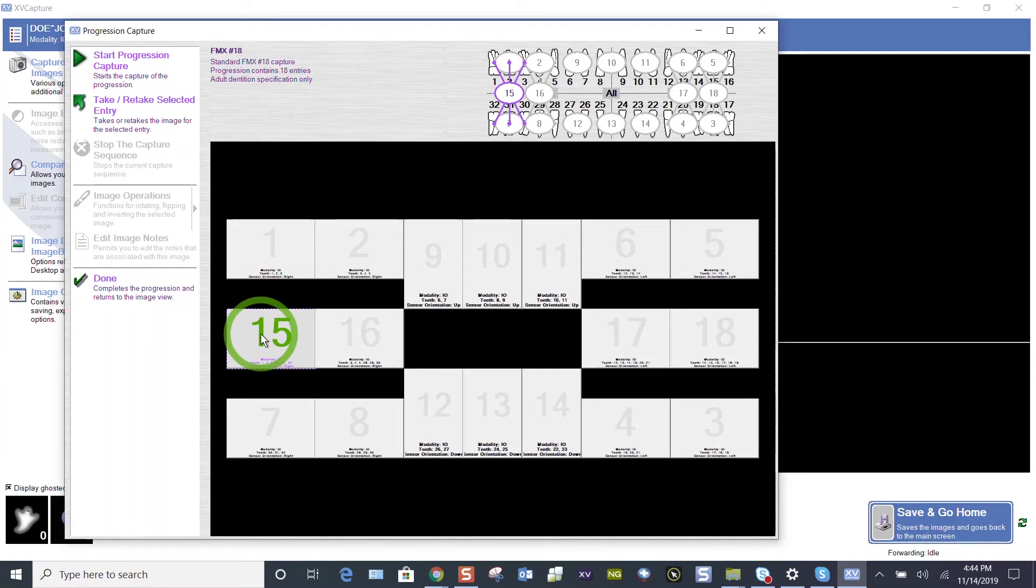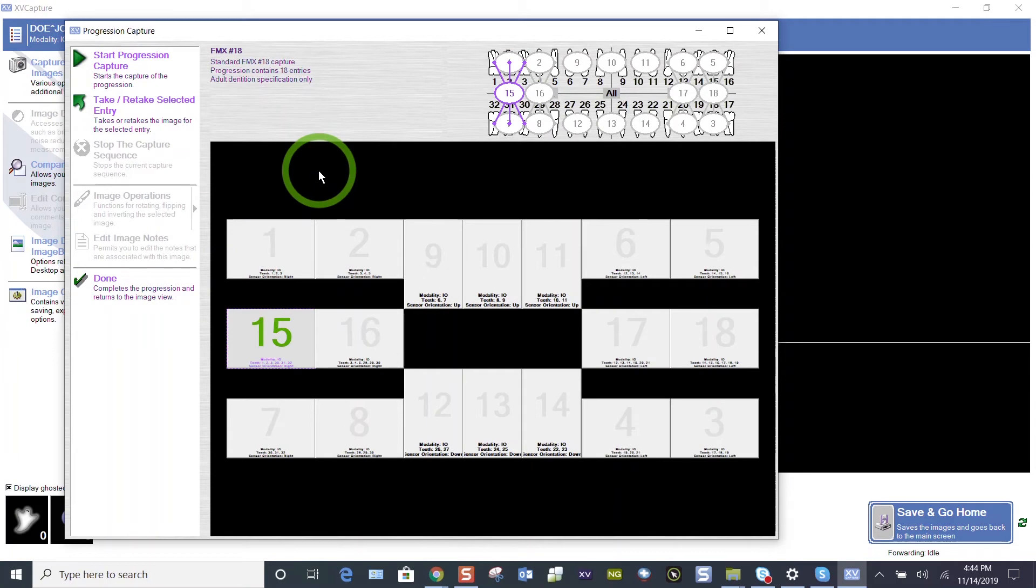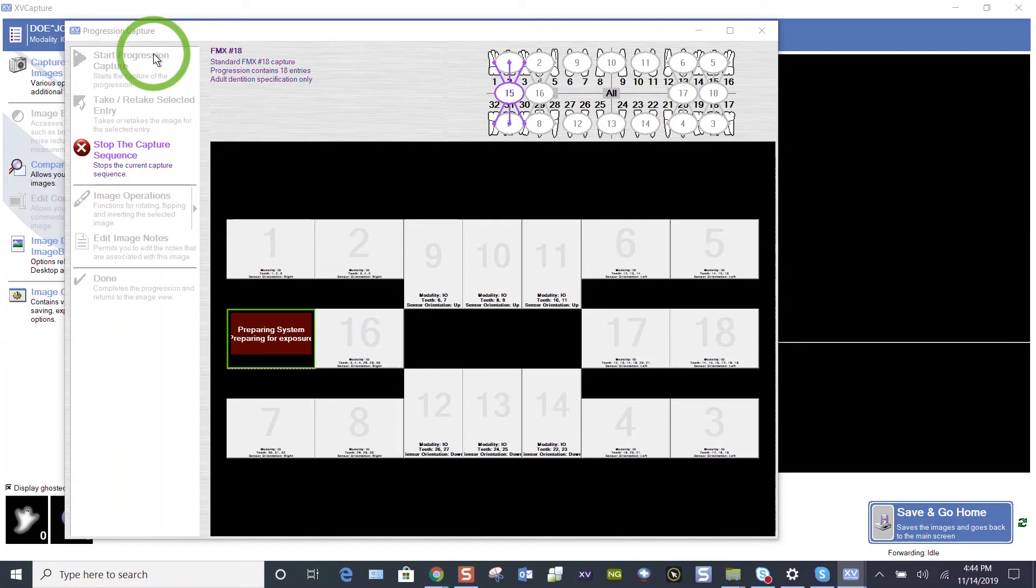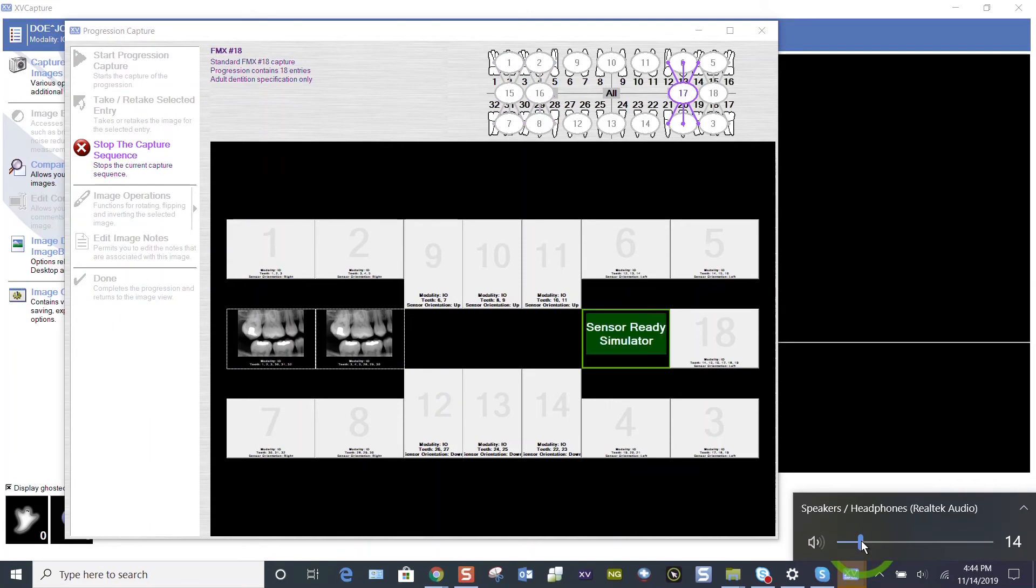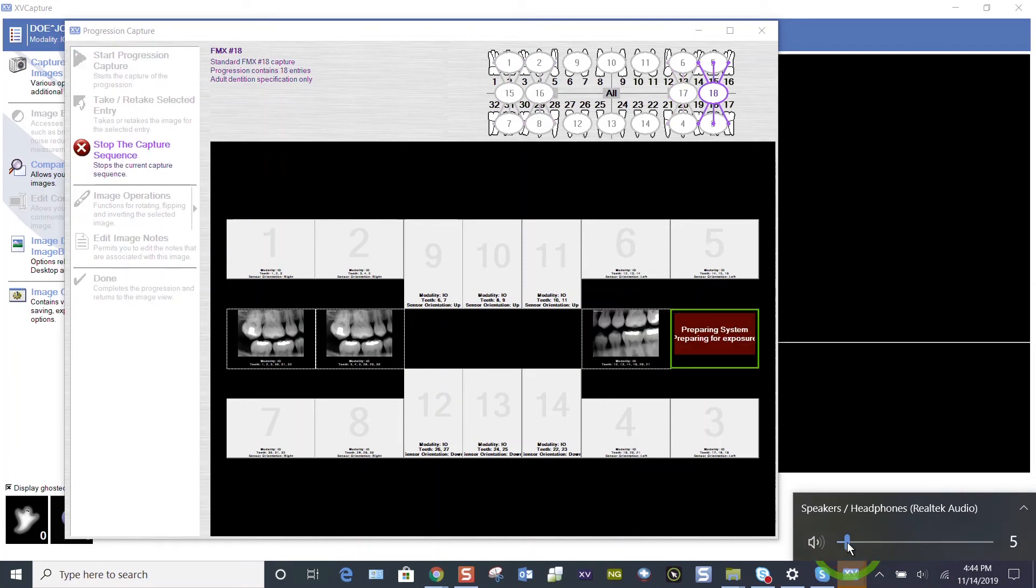When we're ready to take images, the start progression, that progression is key. It's going to progress in numerical order through this layout. Let's hit start progression capture. Our sensor is going to tell us it's ready. We can disable that voice if we want, or just turn your volume down on low.